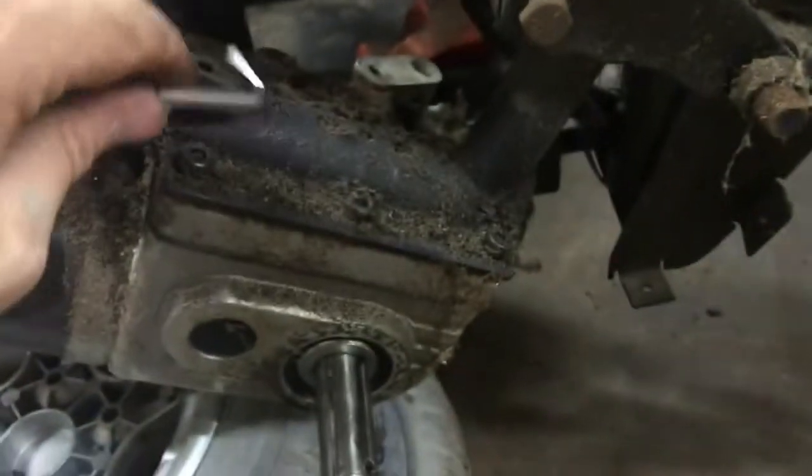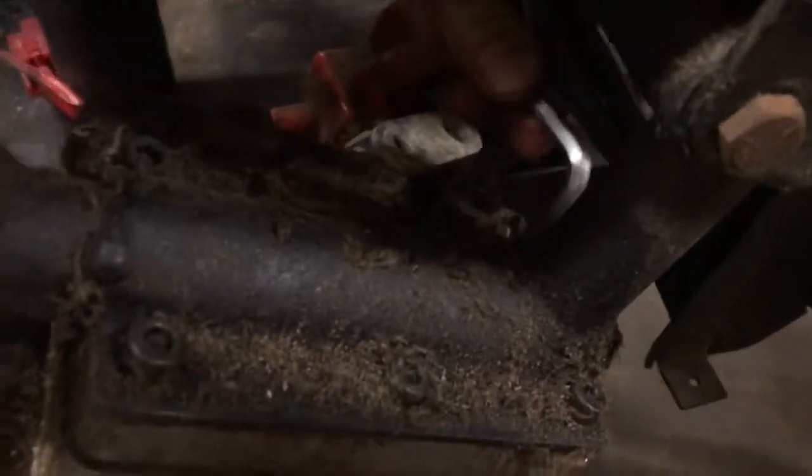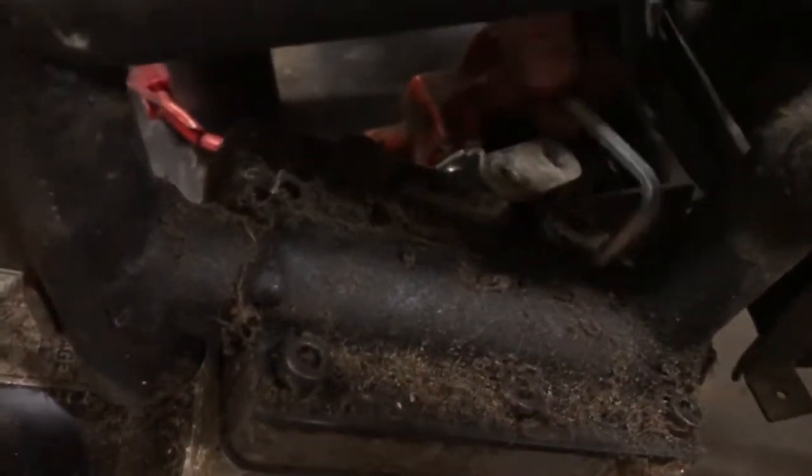Okay, I'm out of focus. Come on, iPhone. So I'm going to go ahead and take this one just about all the way out.